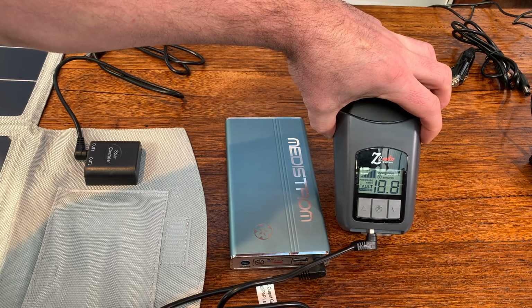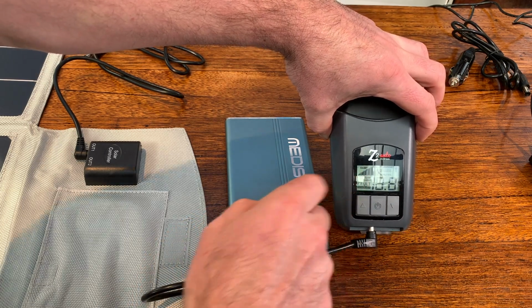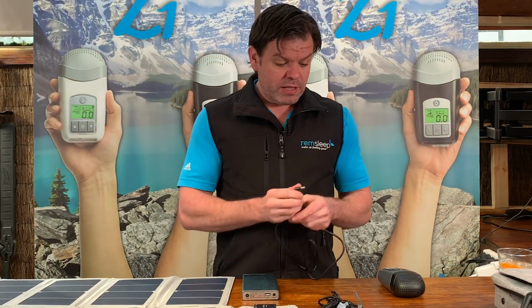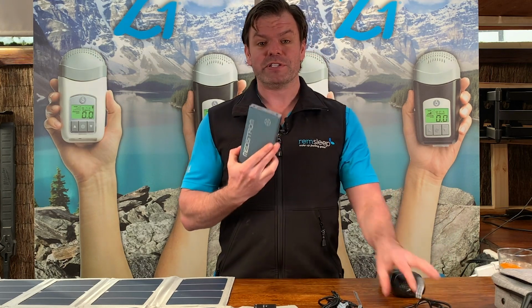Okay, so you can start using that straight away. You can see the screen lighting up there. Just hit your on button and you're good to go. So that's pretty straightforward. Now let's talk about charging the battery system itself.